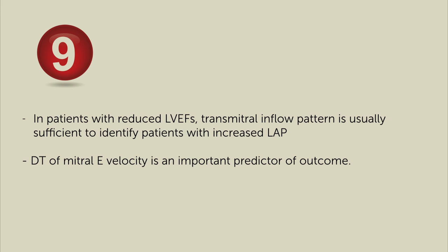What are you supposed to actually look at? The transmitral inflow pattern, and that is usually sufficient to identify patients with increased filling pressures. So can you comment on that maybe? Yeah, it's the same as before. As long as it's typical, for example, E to A ratio more than 2, so everything is clear, it's restriction. And then you don't have to fulfill other parameters. Right. So yeah, in that case, it's clear. So it's a lot easier.